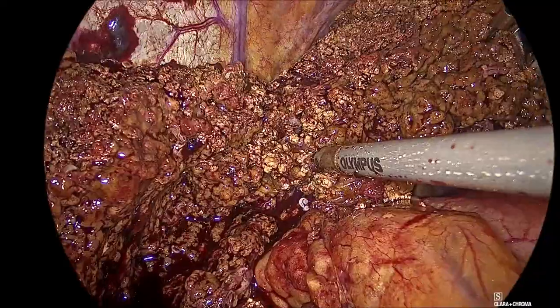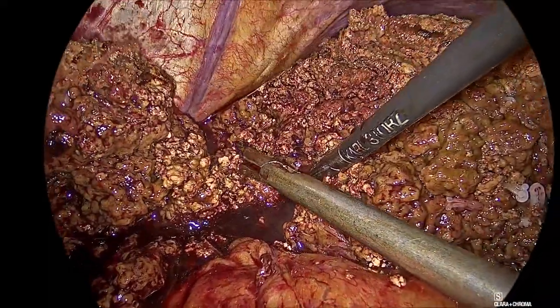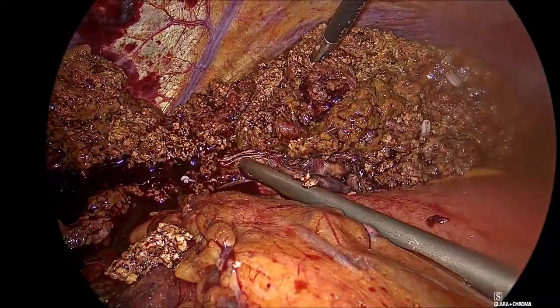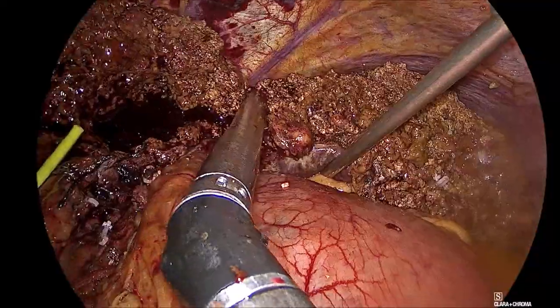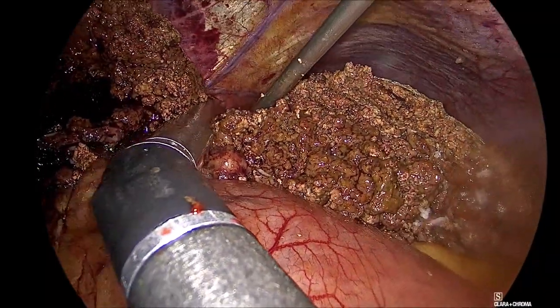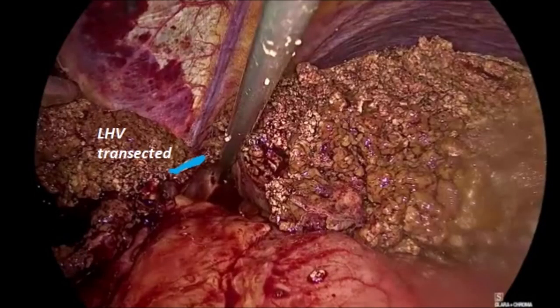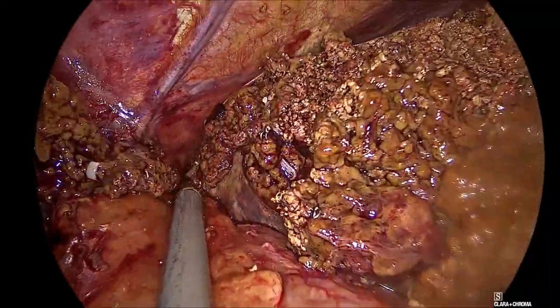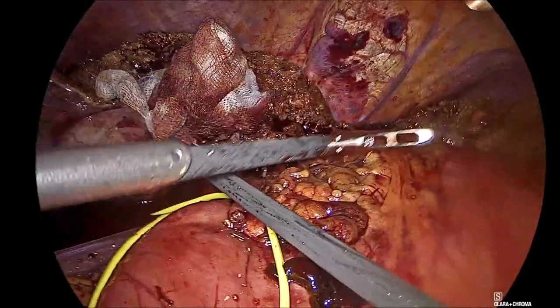Once the metastasis was freed anteriorly, posteriorly we had parenchyma and a few hepatic venous branches, which were taken down sharply or with CUSA; larger branches were clipped on either side before division. The umbilical hepatic vein — usually a branch of the middle or left hepatic vein or draining directly into the IVC — was identified, clipped, and divided. The last parenchyma along with the left hepatic vein was taken with a blue stapler. Any residual parenchyma left for safety was secured with a Hem-o-lok and divided. Last attachments of the left coronary and triangular ligaments were taken down with Thunderbeat, which coagulates and dissects simultaneously, reducing instrument exchanges and operative time.